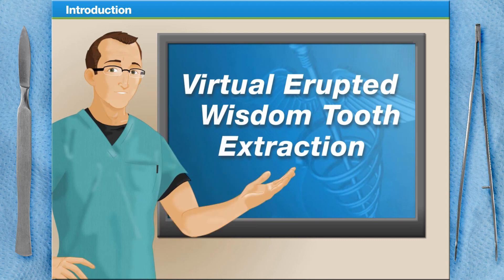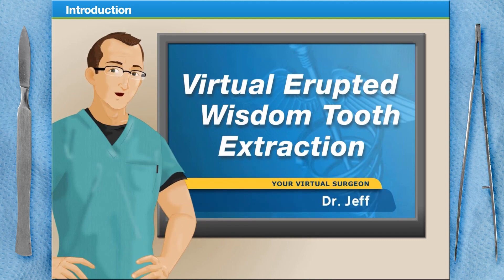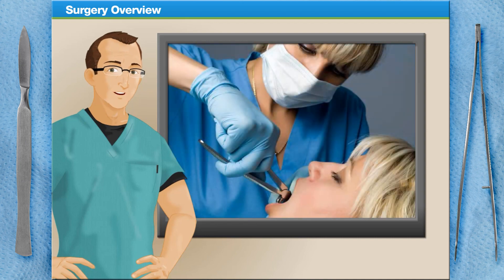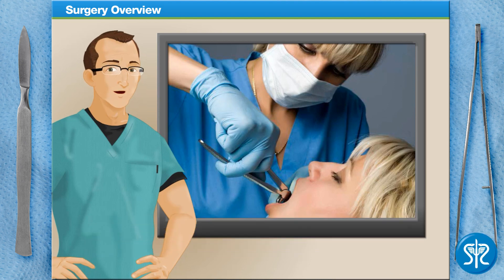Welcome to Surgery Squad's Virtual Erupted Wisdom Tooth Extraction. I'm Dr. Jeff and I'll be walking you through this procedure today. A wisdom tooth extraction is a surgical procedure in which an oral surgeon or dentist removes one or more of your third molars, commonly known as wisdom teeth.